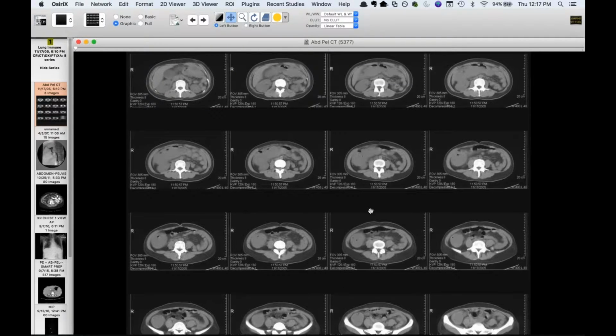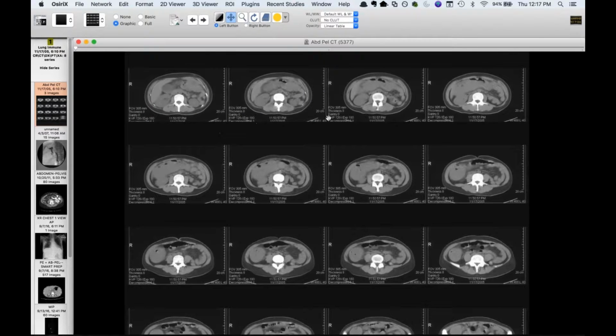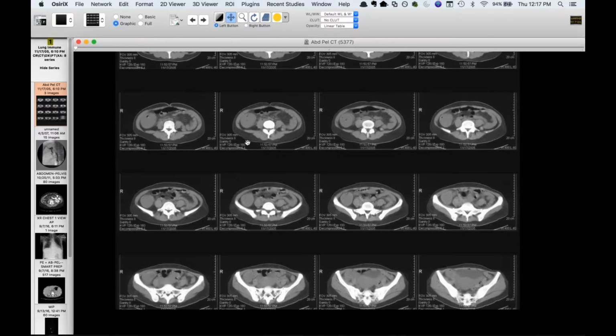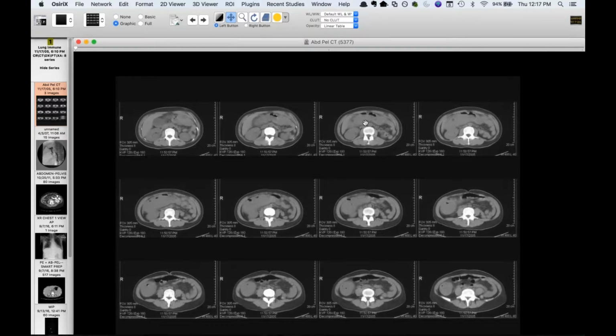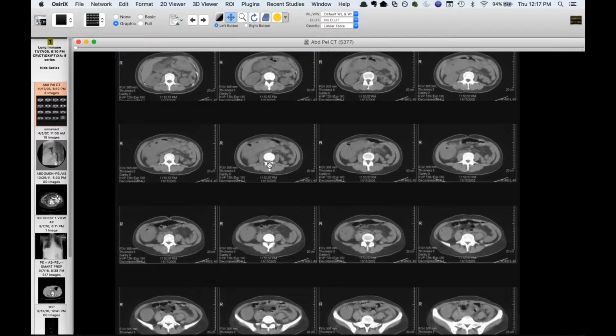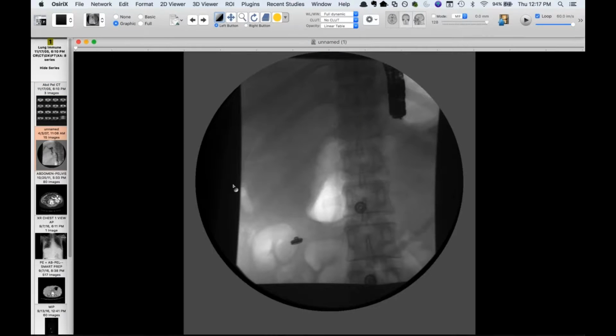As you can see, 2005 is when this lady's issues start. And this is one of those diagnoses, the eventual diagnosis, that just kind of hoses us every time. And it got me this time, too. You can see that she's got this big hepatic flexure soft tissue mass, and this was back in 2005. And so they took this out. And I don't even know, they did partial colectomy, all this other stuff, and it was diagnosed as a spindle cell neoplasm, possibly an inflammatory myofibroblastic tumor, and that was 2005. And that was somewhere else.